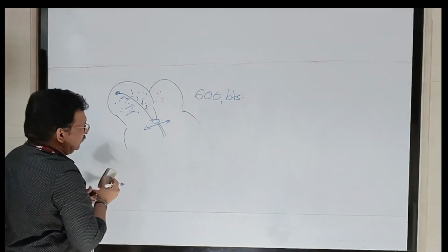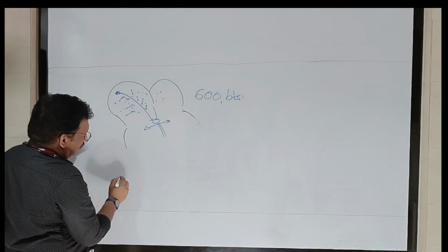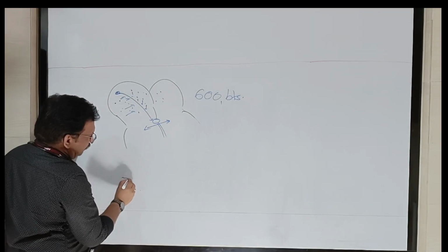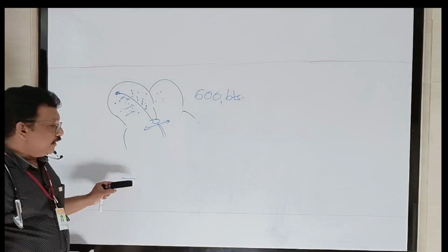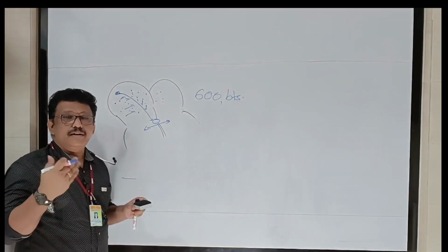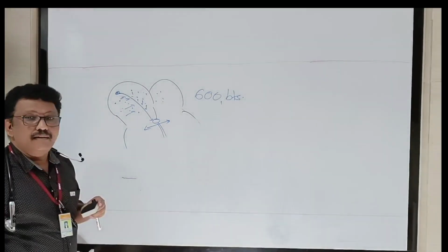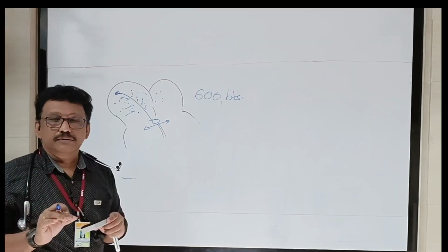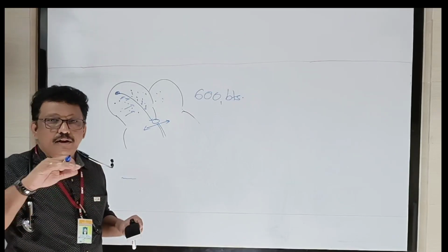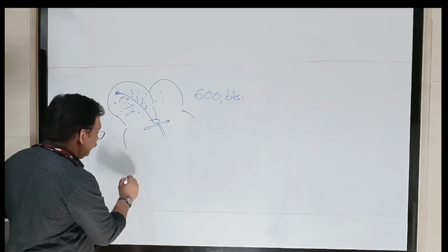Now we can see first the wave pattern. So there is a wavy baseline. That means a large number of fibrillating waves are seen in the baseline. They all are P waves, but a normal morphology P wave you never see. It's only wavy baseline.